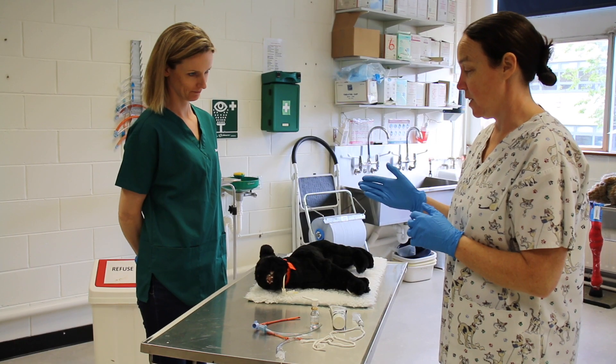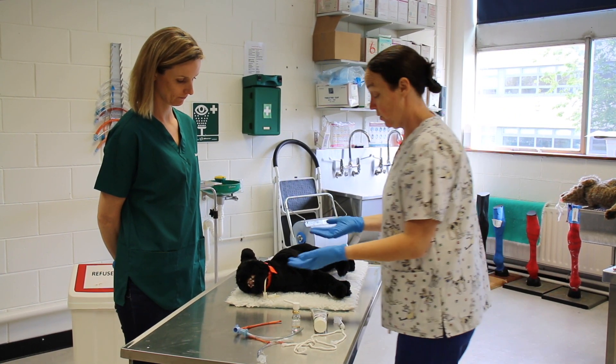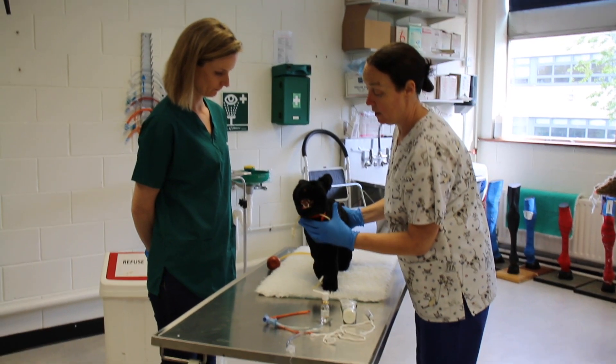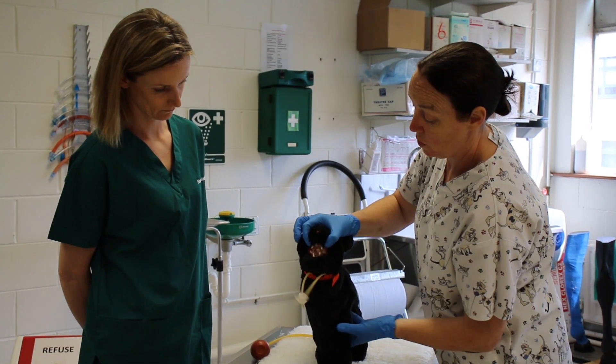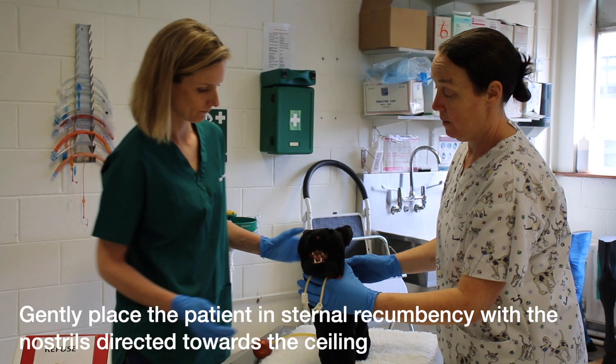We need to give our assistant clear instructions for handling the patient. Place the patient into sternal recumbency. Place your two fingers beside the canines but not inside the patient's mouth in case it bites. Direct the nose towards the ceiling.